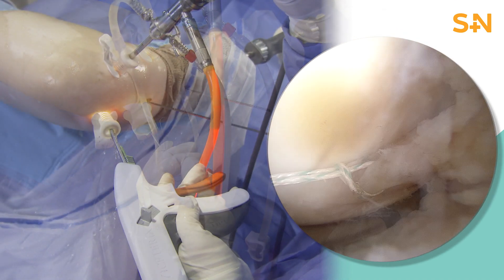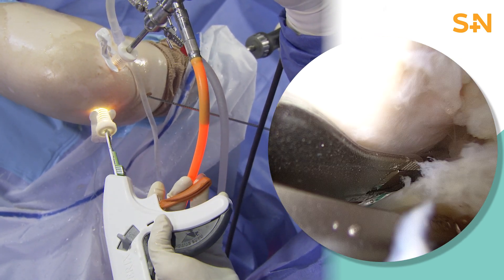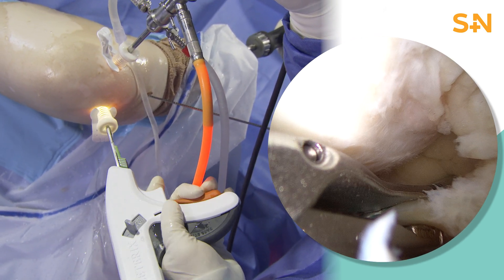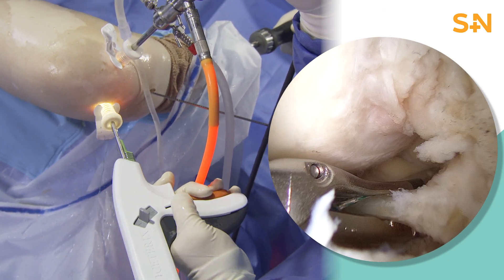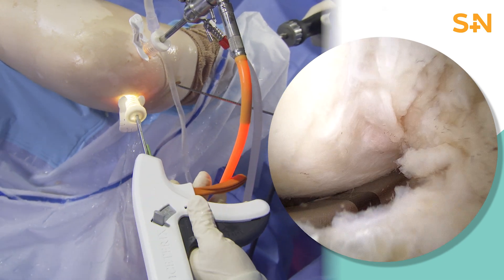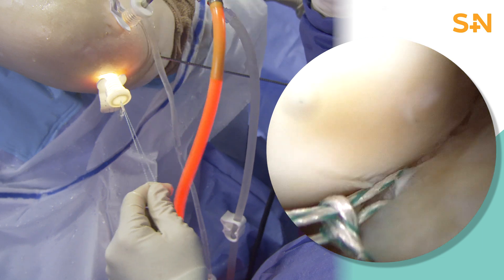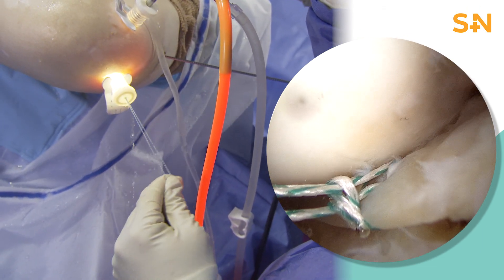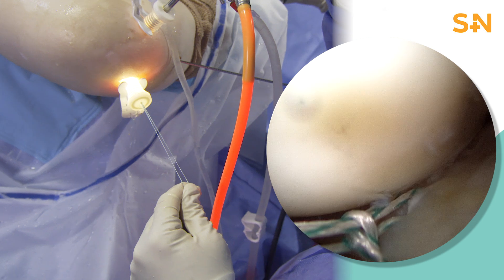In this case, we're going to place two of these. I find that two modified double locking loops through one tunnel in the tibia is excellent fixation for the majority of meniscal repairs. In this case, I've done two horizontal passes, one more central and one more peripheral in the meniscus. It's essential when placing that second suture that you want to make sure that you don't cut through the first suture, compromising your overall fixation.